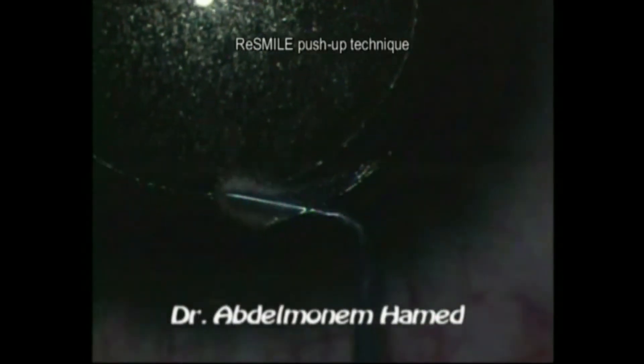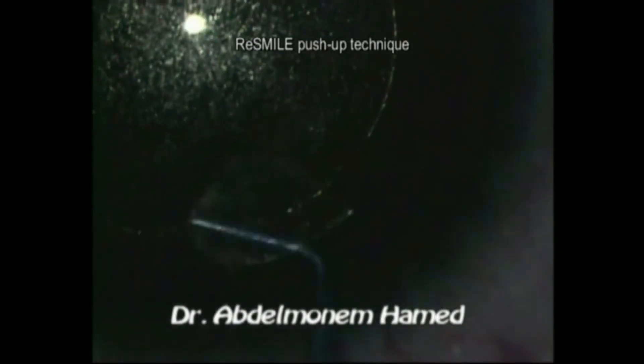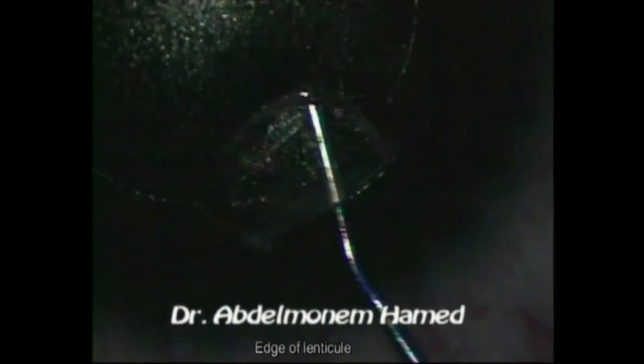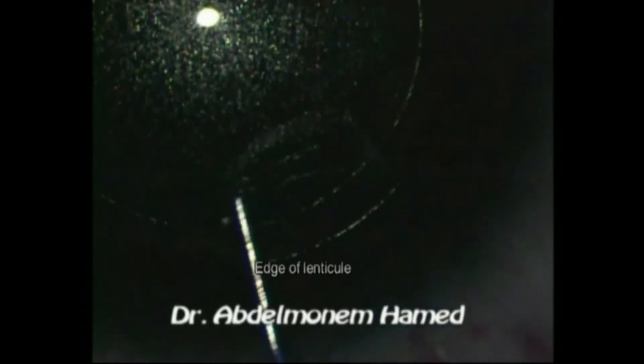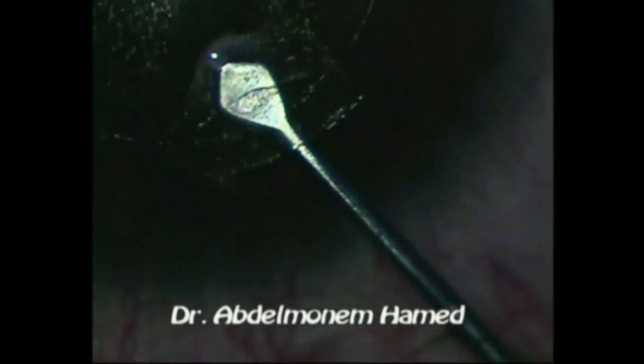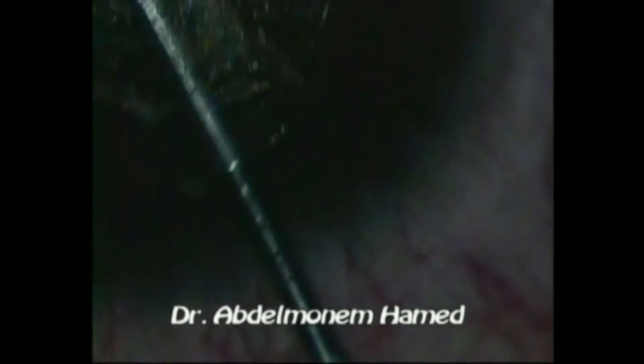The refractive small incision lenticule extraction re-SMILE push-up technique was then used to facilitate recognition of the edge of the lenticule inside the pocket through the coaxial illumination of the VisuMax femtosecond laser machine microscope. The lenticule was then dissected and removed through the primary SMILE corneal wound.